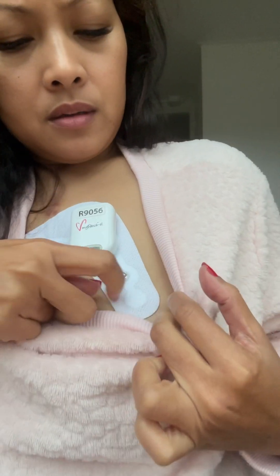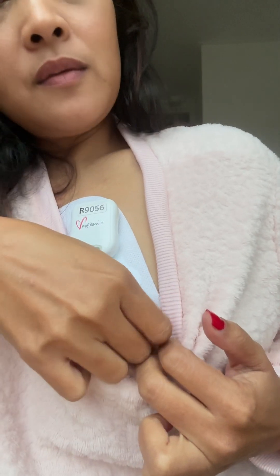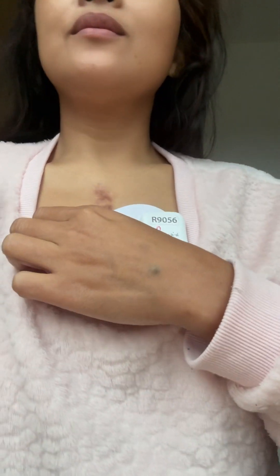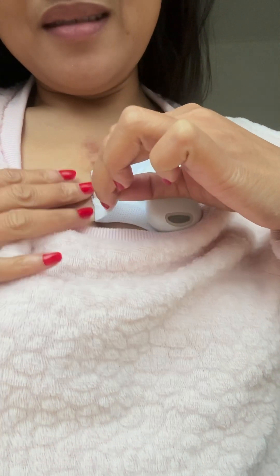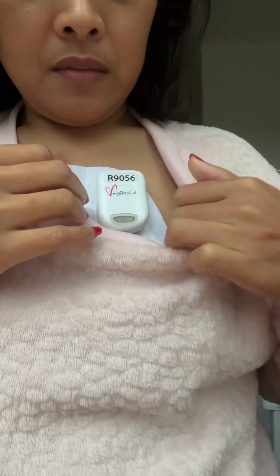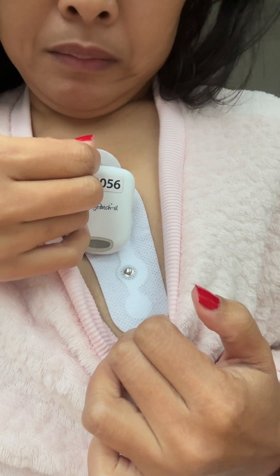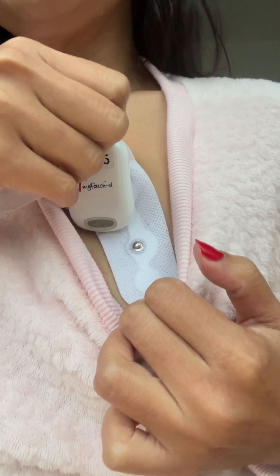It records your heart activity and it has a continuous ECG. I went to my cardiologist a few days ago because I'm having heart palpitations more often. So I have this device so they can record my day-to-day activity without staying in the hospital. I'm taking this off very slowly and I'm going to send this to my cardiologist so they can see what's going on with my heart and why I'm having these heart palpitations.